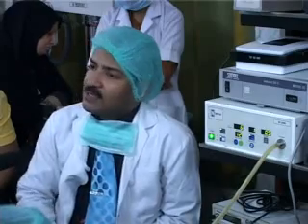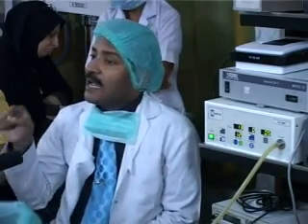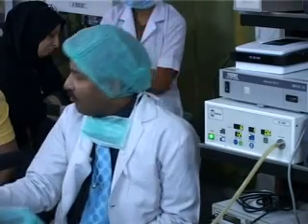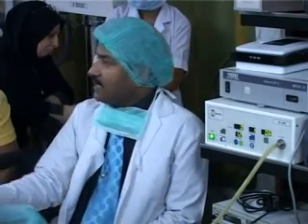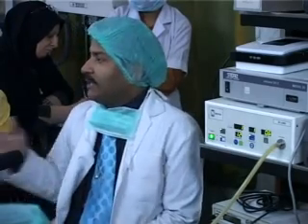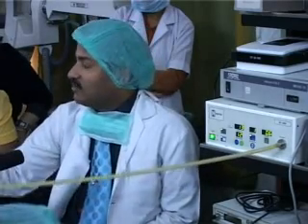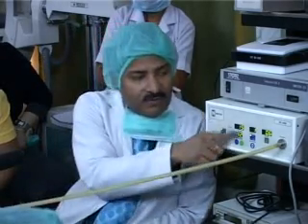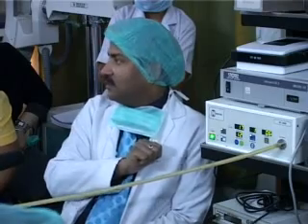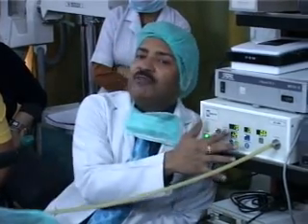The second advantage of the pulsatile pressure is that it will sense the real intra-abdominal pressure when it is off. There is one problem with the Veress needle. When it pushes the gas, due to resistance of the eye of the Veress needle, there is always one error. So the actual pressure is the minimum of the 5 readings.